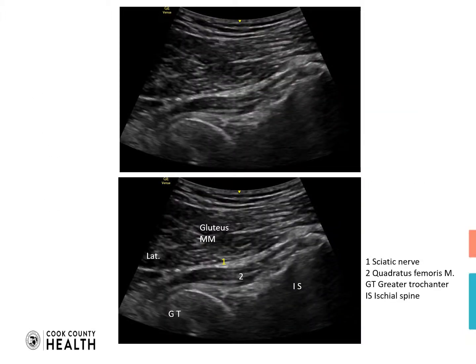With the probe in the mid-gluteal region, the sciatic nerve is observed between the greater trochanter and ischial tuberosity. The easiest approach is to introduce the needle out of plane, passing through the gluteus muscle into the surface of the sciatic nerve.